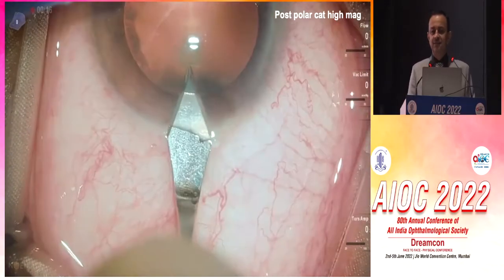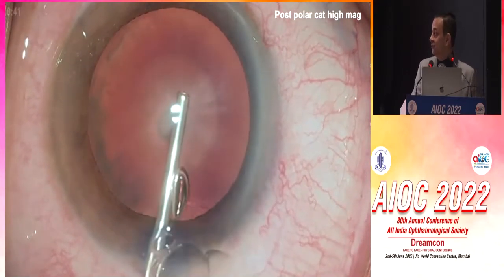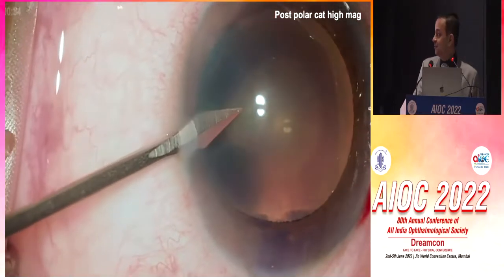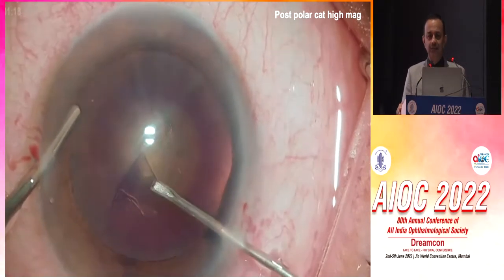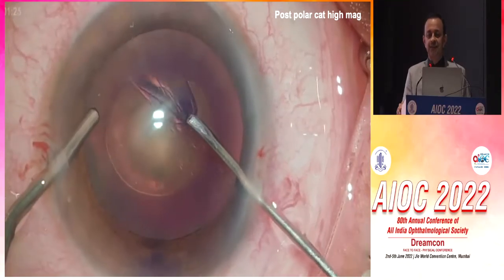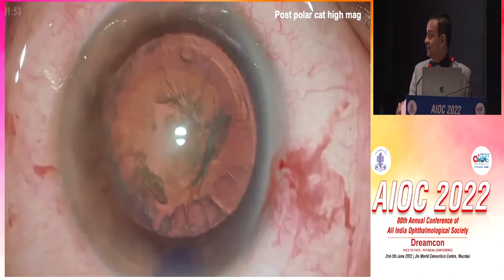Now look at this particular video. This is all anterior segment because I have been asked to speak on anterior segment. This is a high magnification video which I am operating on a 3D system. This is a posterior polar cataract. Look at the volume, how big. Anything which you see big, you can pick out the smallest of the things, and if you can see the smallest of the things, the predictability is better and the chances of iatrogenic damage to the adjacent tissues are less. So you can see the comfort of the magnification.